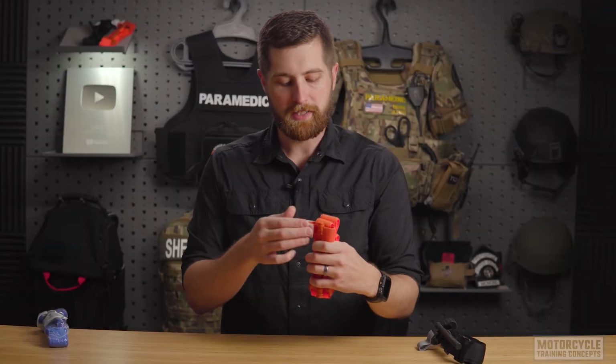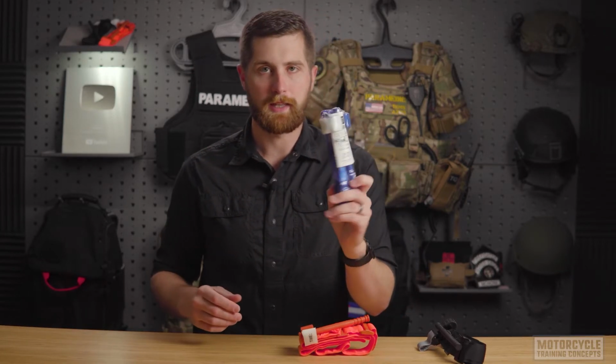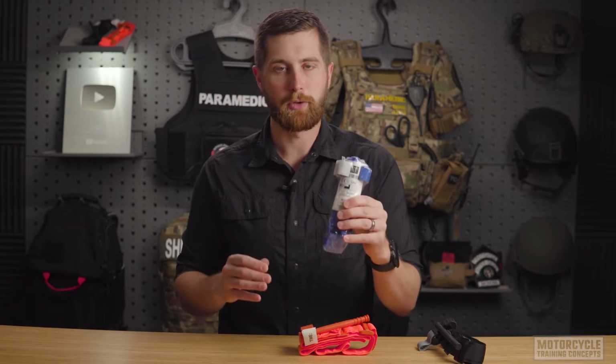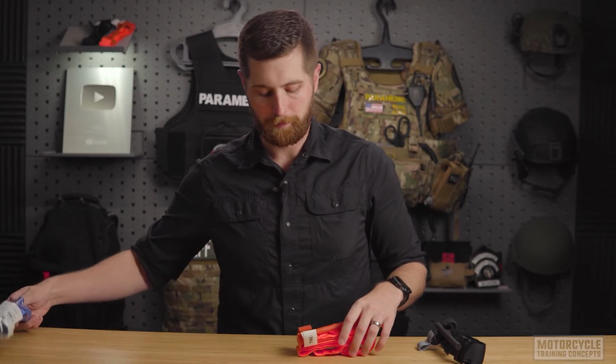pressure. The second mistake I see people making is they keep the tourniquet in the plastic that it comes with. While this plastic doesn't seem like a big deal, it can delay you in its application and should never be left on for any period of time.